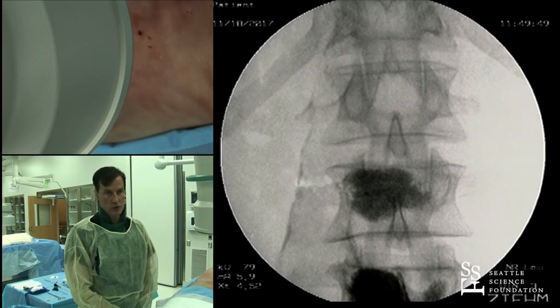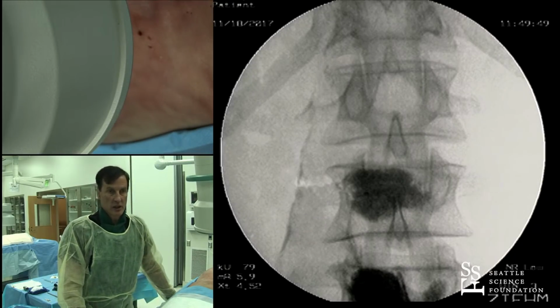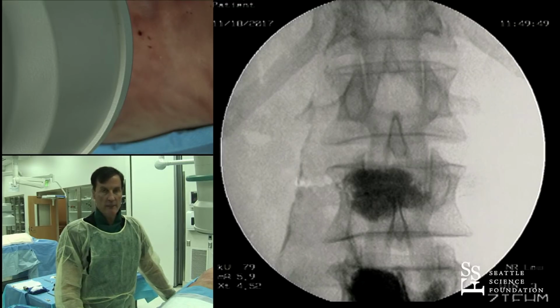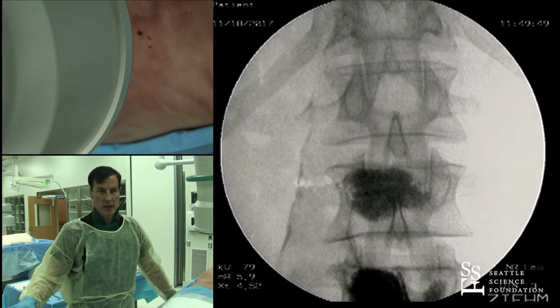What you want to do is have this vertebral body be able to support force over time and not break down. One of the errors that people make is not putting enough material in, whether it be implant or cement. If you're using implants, that's fine, put implant plus cement. If you're using just cement and balloons, put in enough cement. On average, the Swiss registry says 5.5 cc's of cement or more gives you better results.